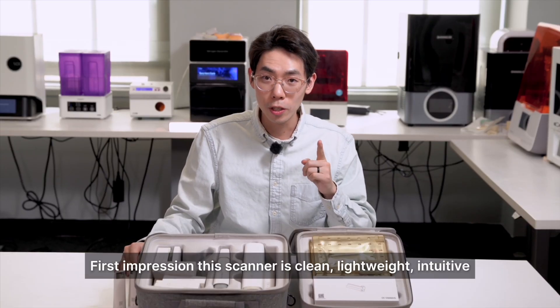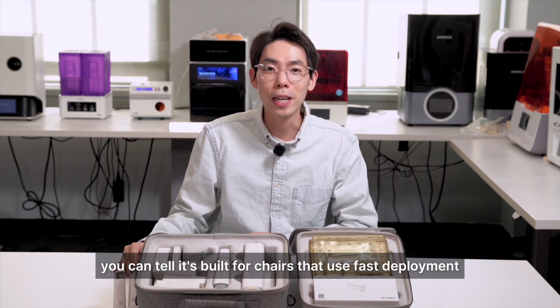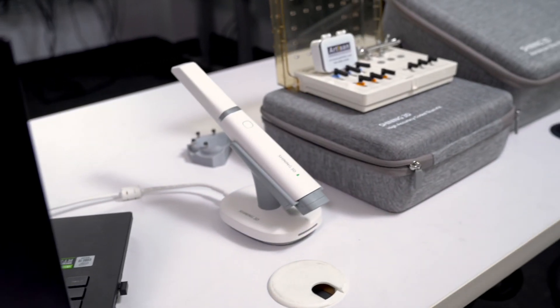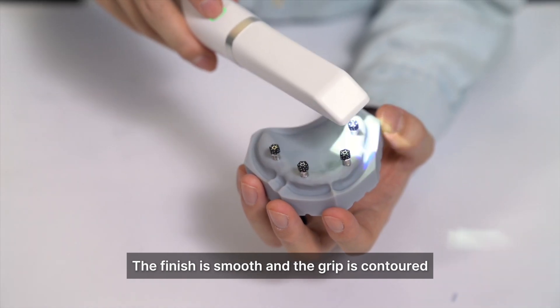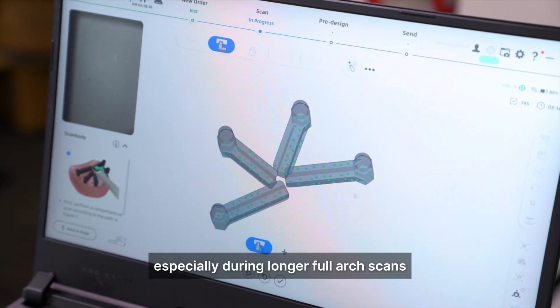First impression? This scanner is clean, lightweight, and intuitive — you can tell it's built for chair-side use. No wires, no clutter. The scanner weighs just 124 grams and measures 245 millimeters in length. The finish is smooth and the grip is contoured, which I think is going to help with control, especially during longer full-arch scans.